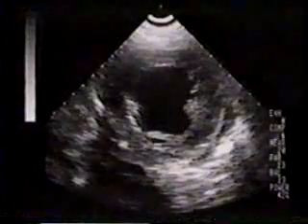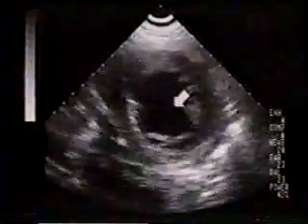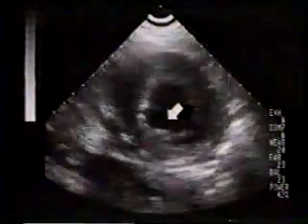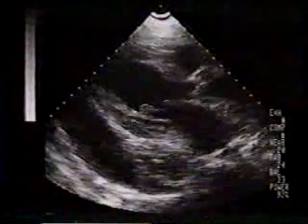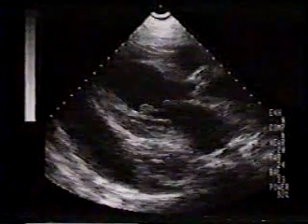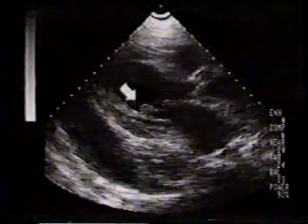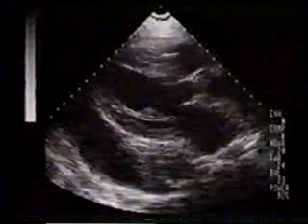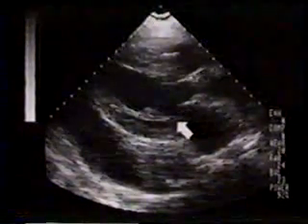We will now scan upward to the heads of the papillary muscles. Notice the wobbling of the posteromedial papillary muscle. This is a parasternal long axis view. This is the base of the papillary muscle, and this is the partial rupture. In systole, you can see that the distal portion of the anterior mitral leaflet is not properly supported.